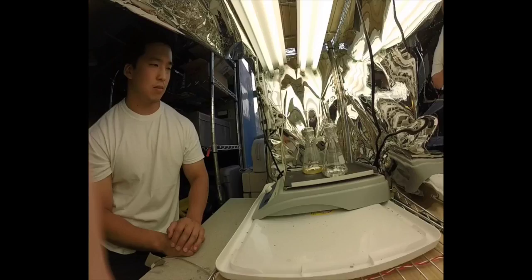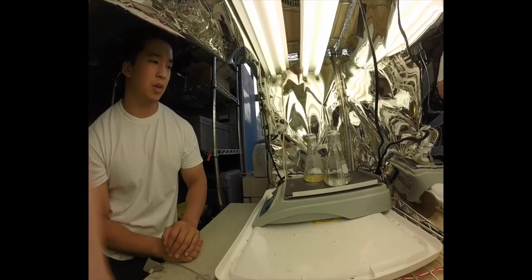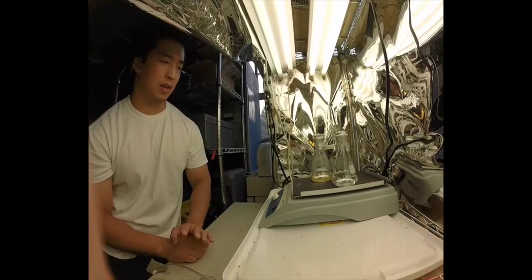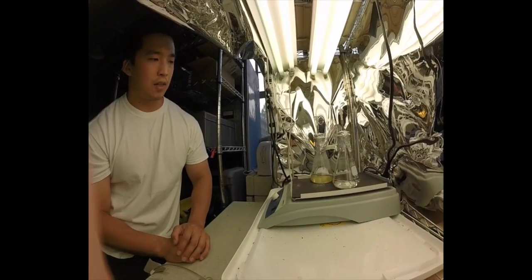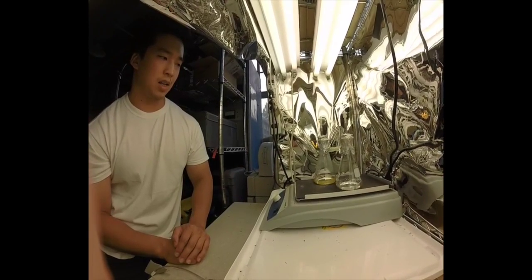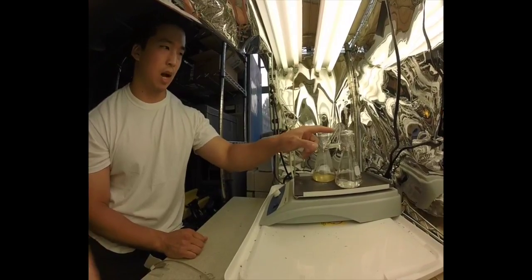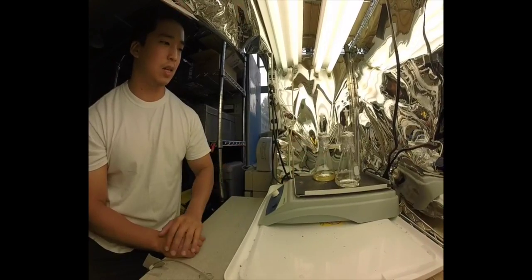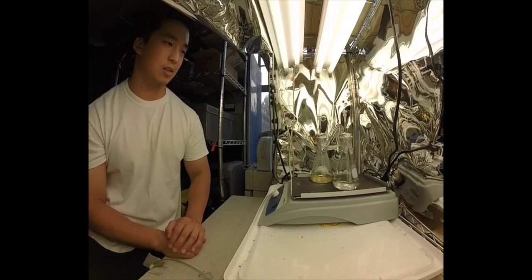Just to note, the cultures, I generally check up on them if I can every day, if I forget every other day. And if the roots don't grow or the Botryococcus doesn't grow in like 3 to 4 days after subculturing inoculation, just make sure there are no leaks, the stoppers are pressed down all the way, there are no cuts in the tubing anywhere and the tubing fits. You might need to zip tie the tubing if you're using the wrong size or a size a little bit too big.